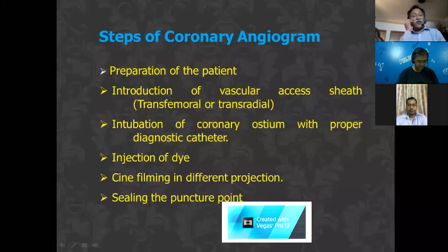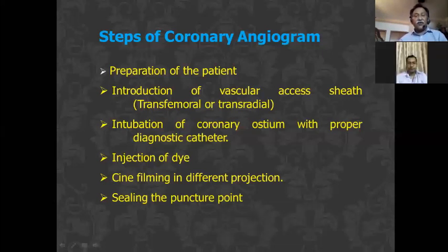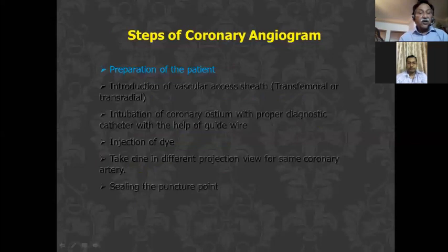Now, what are the angiogram steps? Preparation of the patient, the vascular access, intubation of the coronary ostium, dye injection, cine filming, and sealing the punctures. And one by one, I am going to talk about them. First, the preparation of the patient. Preparation of the patient is very important. The reason is this.